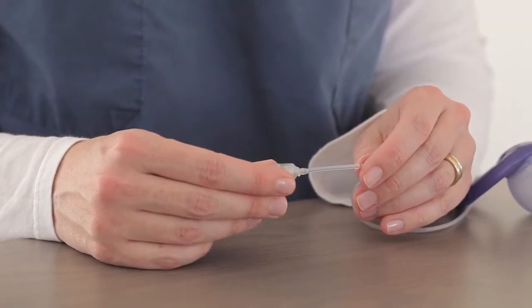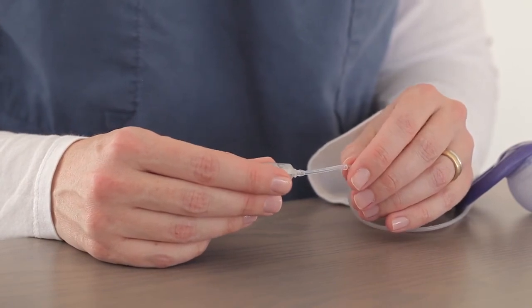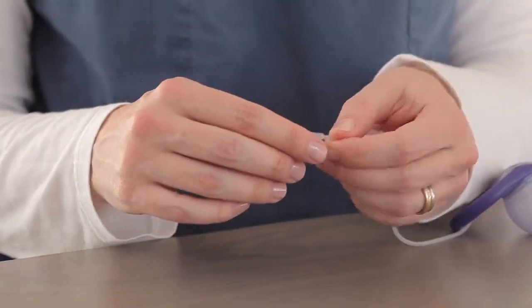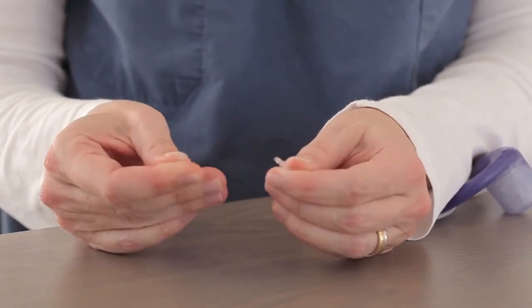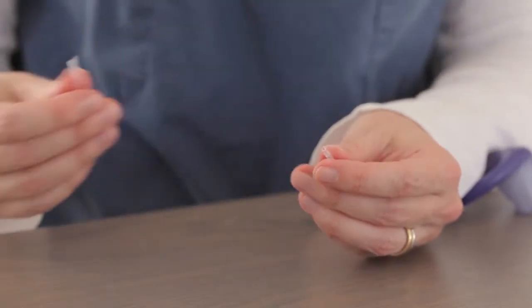If the valve becomes soiled and you are unable to disinfect it, you will need to replace the valve. To do this, simply remove the valve from the connector like that, and you can replace it with a new valve.